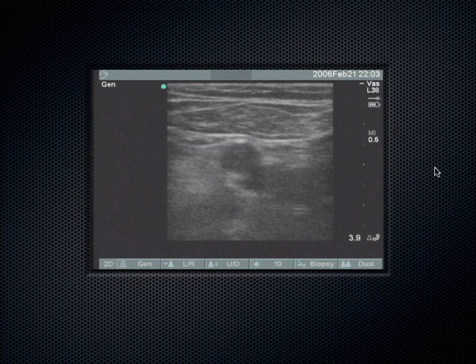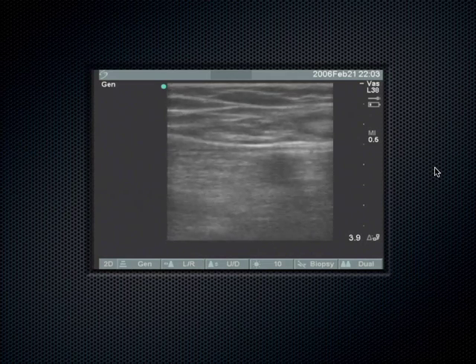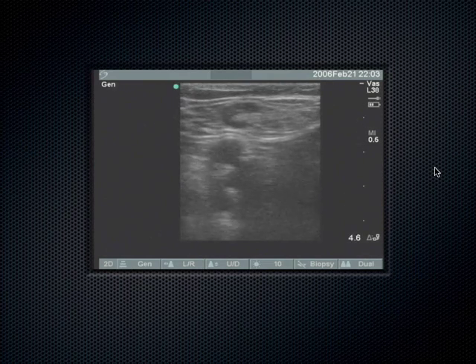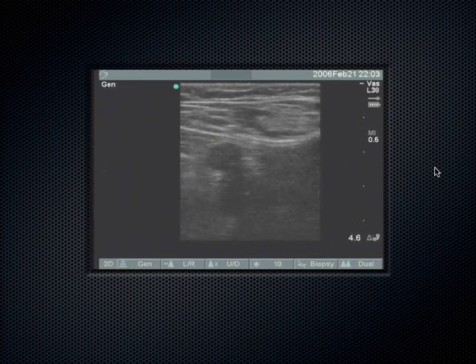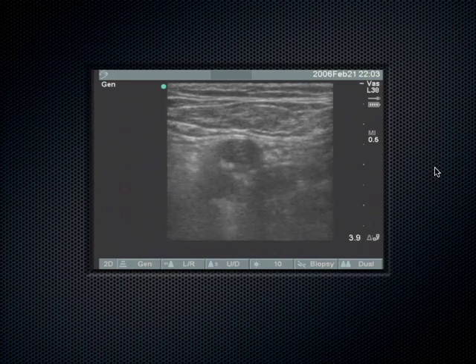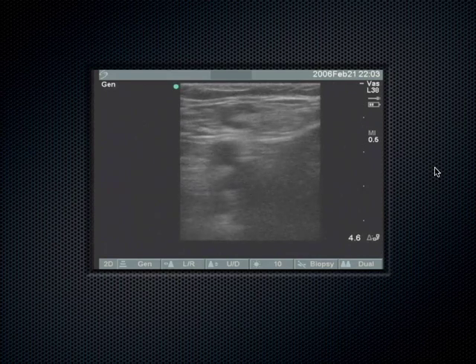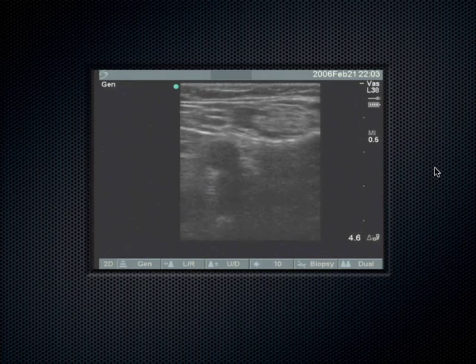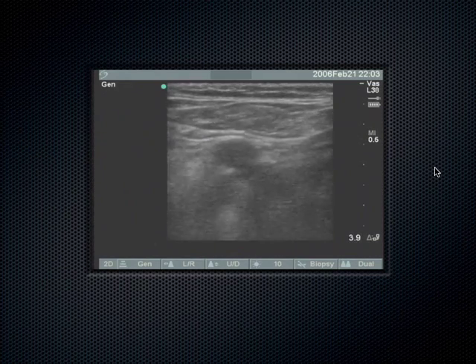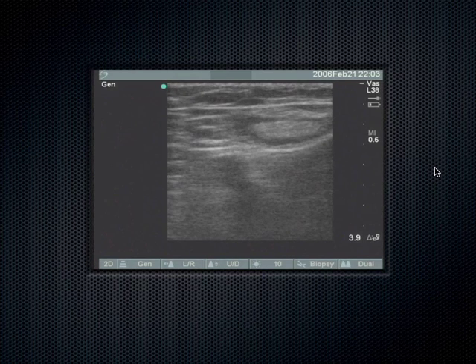But you know what? These patients come in many times who are struggling clinically, they've got this red, kind of swollen leg, and you're like, I don't know, is there an infection here? Is this cellulitis? Or is there a blood clot here? And so this is one way to help differentiate that. You look for a DVT, and it's easily compressible, there's no DVT, and then you see that thing up there. What is that thing up there? See, there it is, right there.